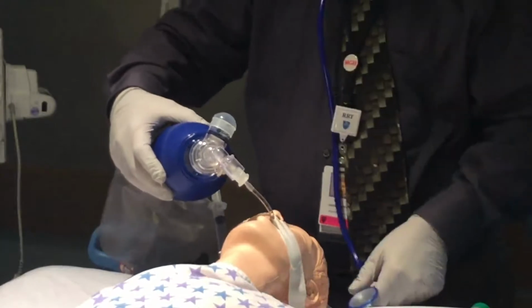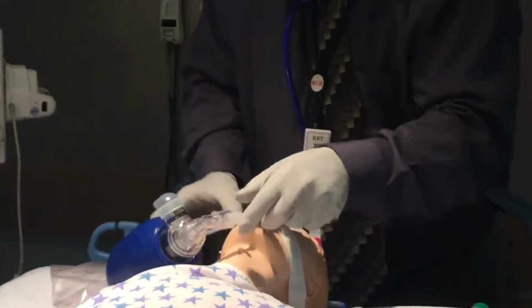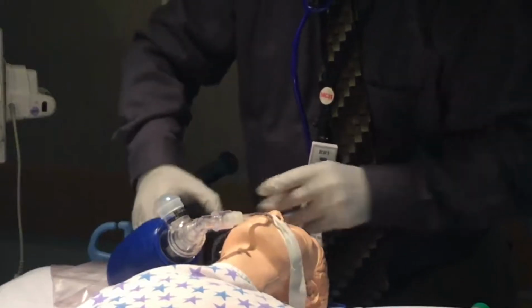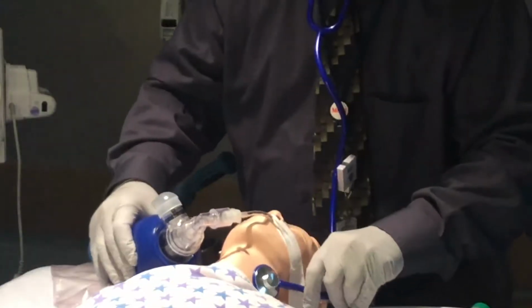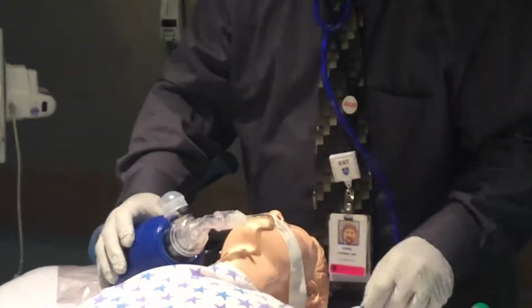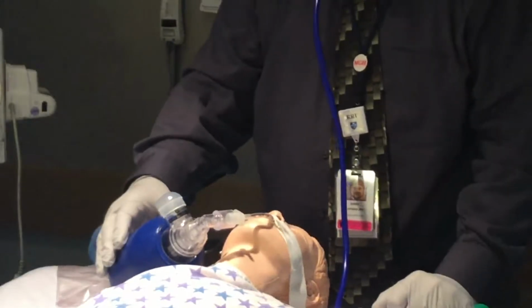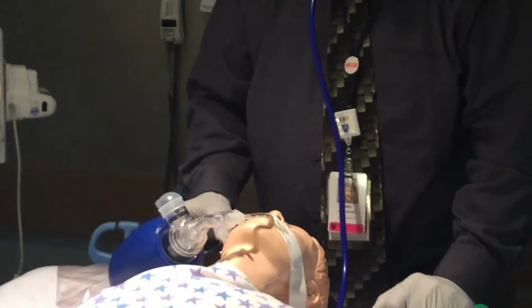If an air leak is present, add just enough air to seal the airway. Measure the cuff pressure again. If the pressure remains greater than 30 centimeters of water: 1. Evaluate the position of the tube in the airway and reposition if needed. 2. Consider other possible causes of elevated cuff pressures. 3. Consider changing to a larger tube.